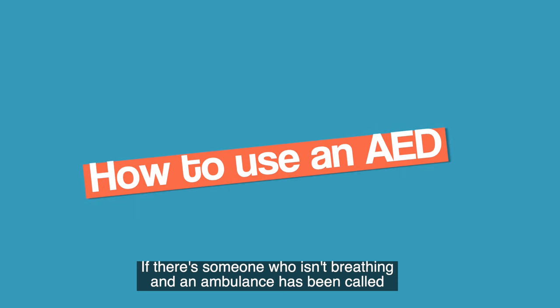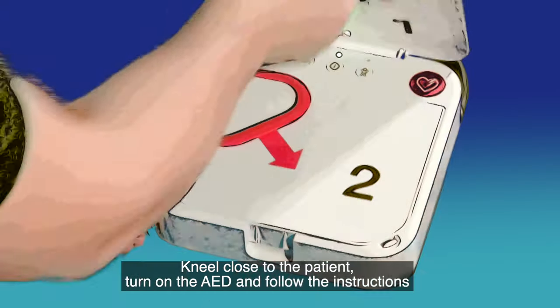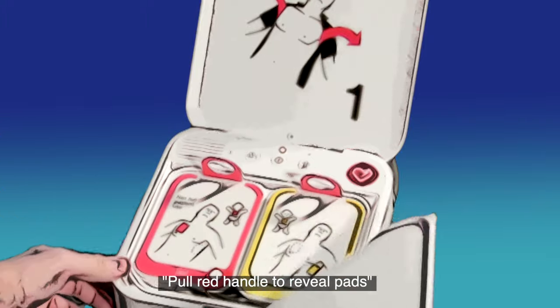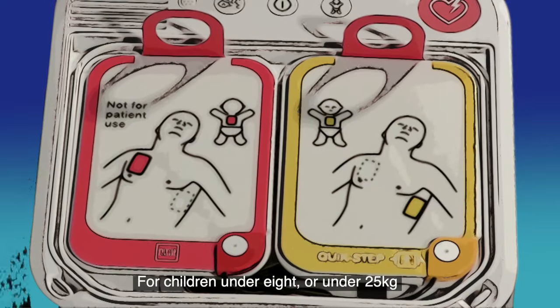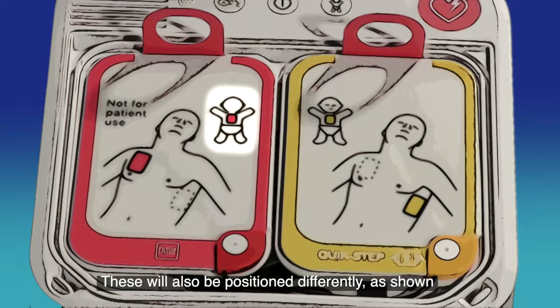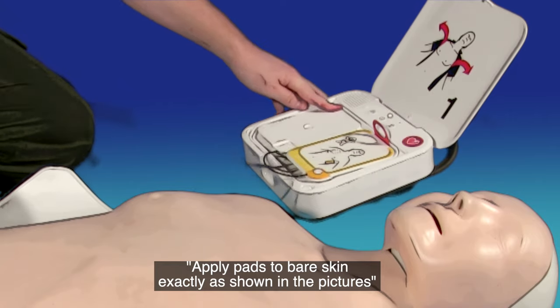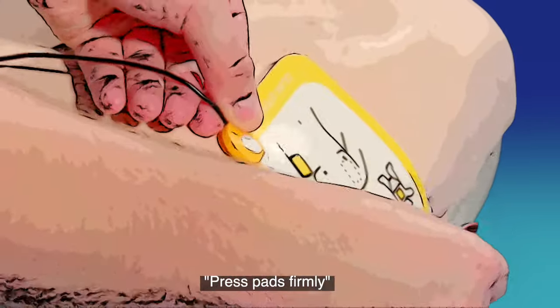If there is someone who isn't breathing and an ambulance has been called, here is how to use an AED. Kneel close to the patient and turn on the AED and follow the instructions. Remove all clothing from the patient's chest, pull the red handle to reveal pads, and look at the pictures on the pads. For children under 8 or under 25 kilograms, there may be a different set of pads, which will also be positioned differently as shown. Apply pads to bare skin exactly as shown in the pictures and press pads firmly.